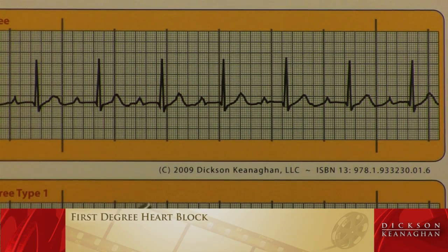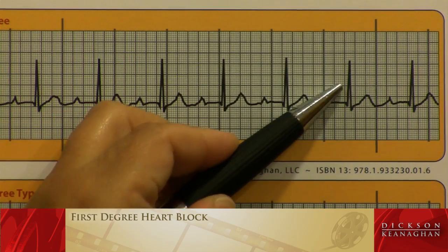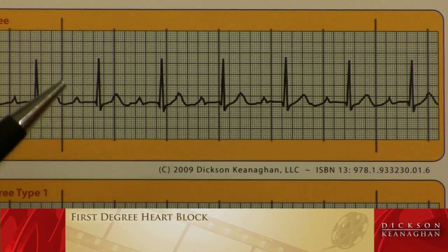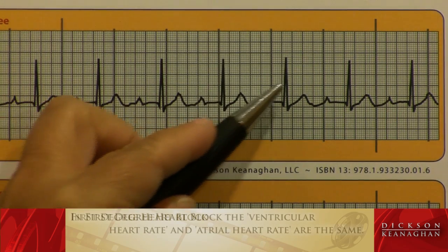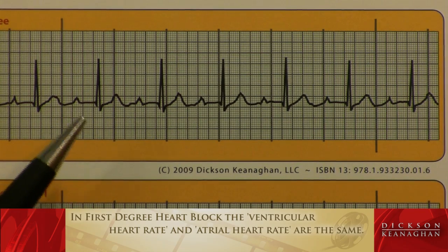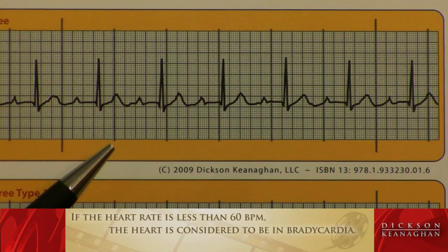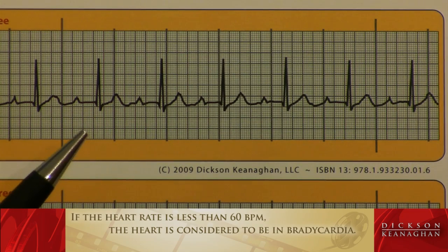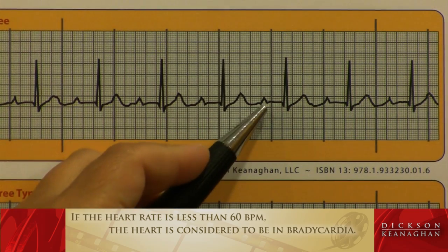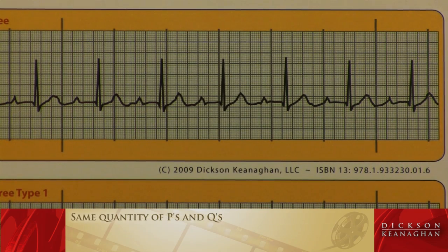The first thing I'd like to do is get the patient's heart rate. If I count the QRS complexes within this six-second strip and multiply by 10, I'll have a ventricular heart rate. Counting them: one, two, three, four, five — multiply five by ten, I have 50. The ventricular heart rate is 50. If the heart rate is less than 60, it is considered bradycardia. I'll also count the P waves for the atrial rate: one, two, three, four, five. The atrial rate is also 50. So there is the same number of P's as Q's in the first degree heart block.